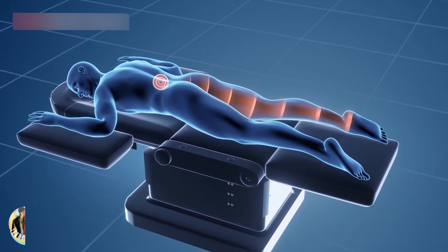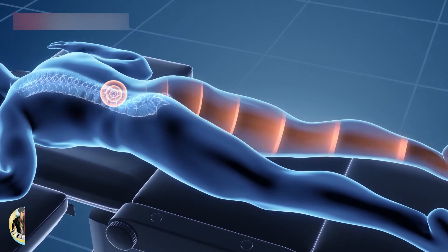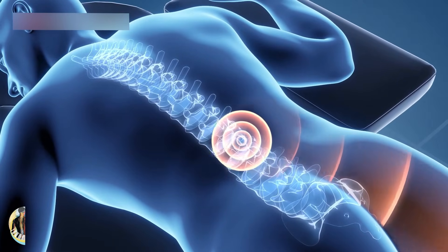This is a procedure to treat a herniated disc — a bulging disc in your spine. Getting rid of the bulge can relieve pressure on your nerves. It can relieve pain in your lower back and in your legs.